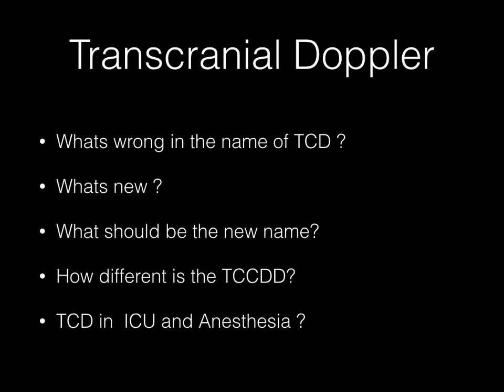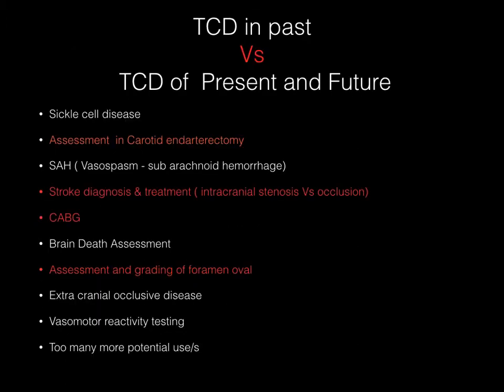So this is used by emergency physicians, can be used in the ICU, in the neurocritical ICU, for anesthesia, for any surgery which involves affection of the brain. So let us go for indications. As I said, in the past there were different, present and future.